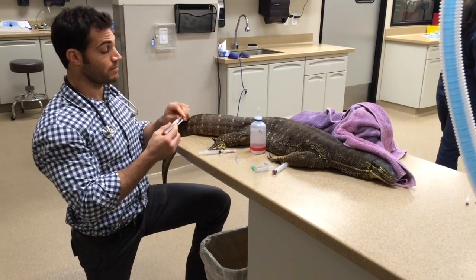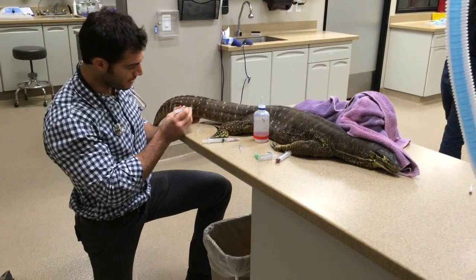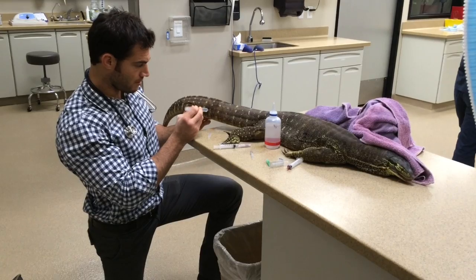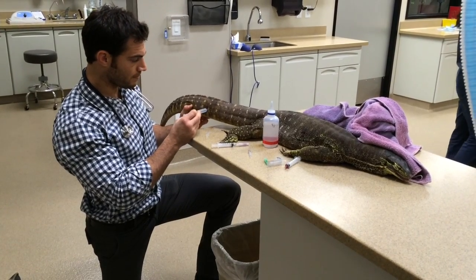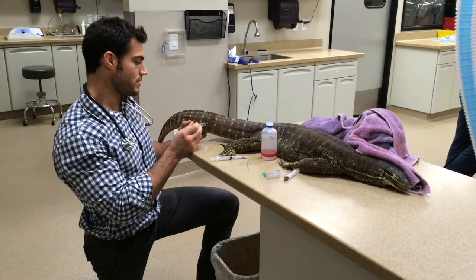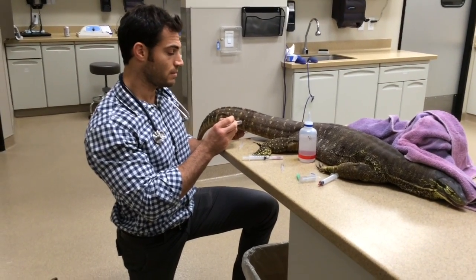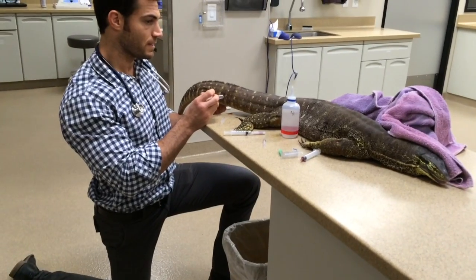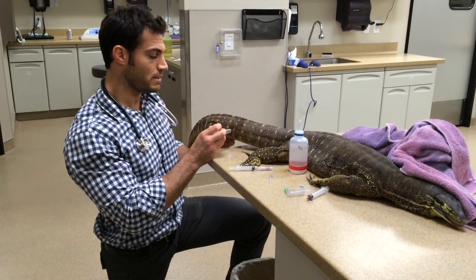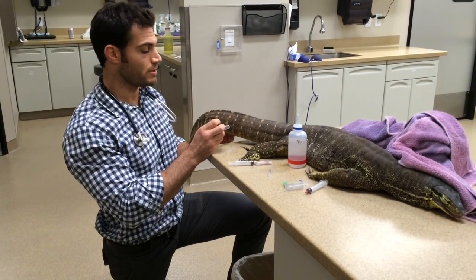We need to assess if we need to resect any more tissue. What I'm doing right now is just inducing anesthesia. We've already given a little bit and that's why she's pretty chill. I'm just going to give her a little bit more here. We're in the vein — you can see that blood coming in the syringe. It's called a caudal vein stick. I'm going to get this guy into a little bit deeper plane of anesthesia, which is going to make setting up for surgery much easier.